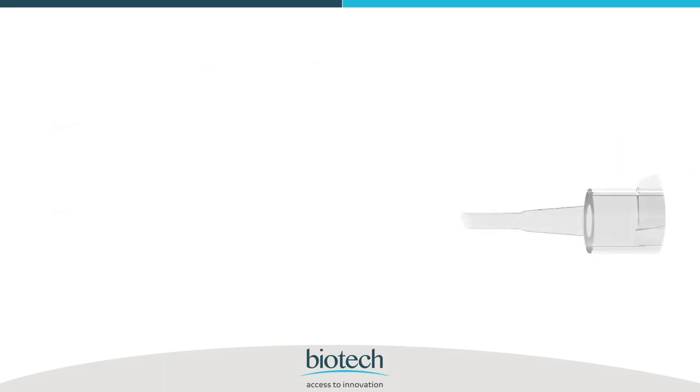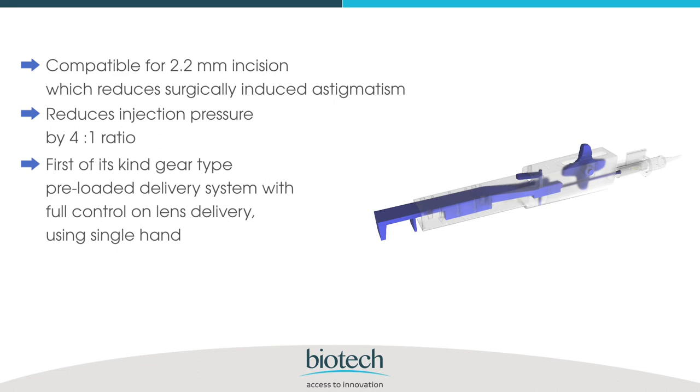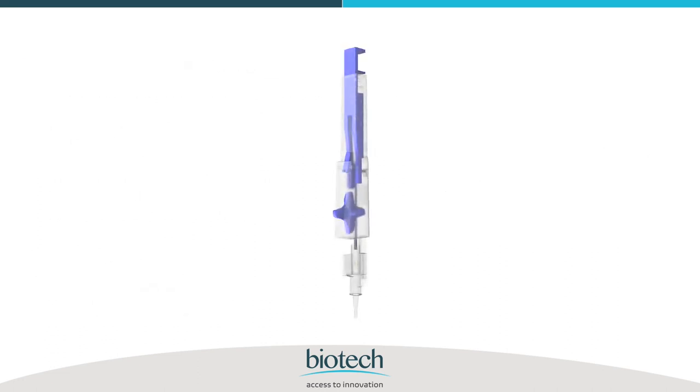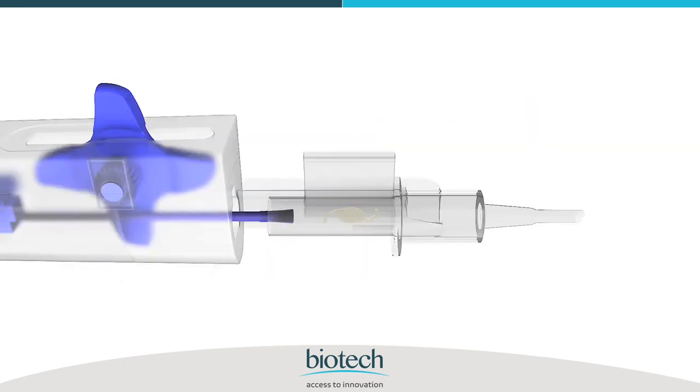The delivery system is compatible with a 2.2 millimeter incision, which reduces surgically induced astigmatism and reduces injection pressure by a four-to-one ratio. It is the first of its kind gear-type pre-loaded delivery system with full control on lens delivery using a single hand, facilitating ergonomic IOL injection and in-the-bag IOL delivery without surgeon manipulation. This disposable delivery system excludes cumbersome steps such as holding the IOL with forceps and loading it into a cartridge.